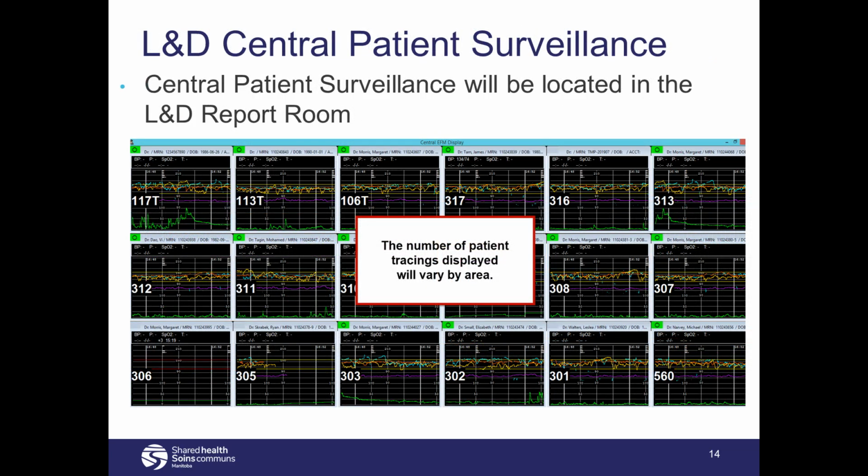In the labor and delivery unit, the central patient surveillance will be located in the L&D report room. This display can be configured to the L&D's workflow requirements.